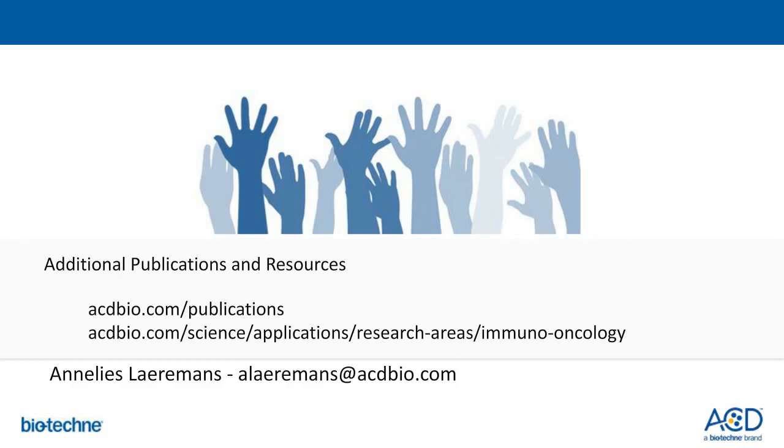How many RNA targets can you detect with dual ISH IHC, and is there a specific order when combining these two assays? So the number of RNA targets that can be used in combination with IHC is up to 4 targets, and it depends on which RNAscope kit you use, so you can use 3 or 4. It is also highly recommended that when you want to combine ISH IHC, that you first run the ISH assay, and then in the end you combine it with the IHC.